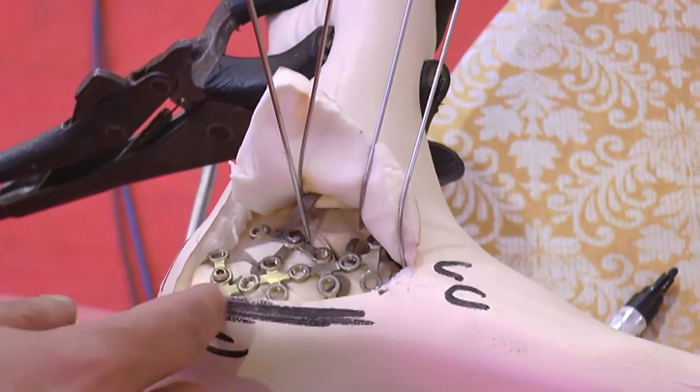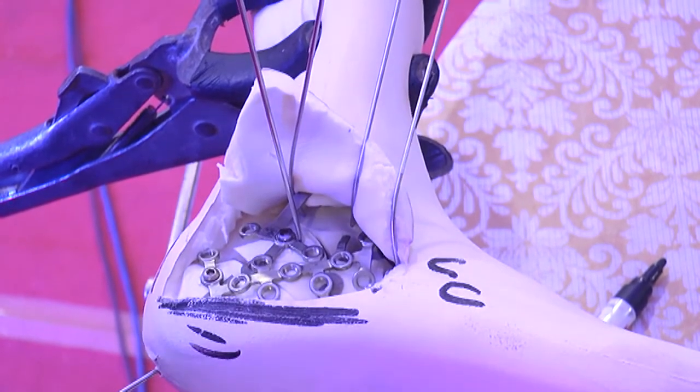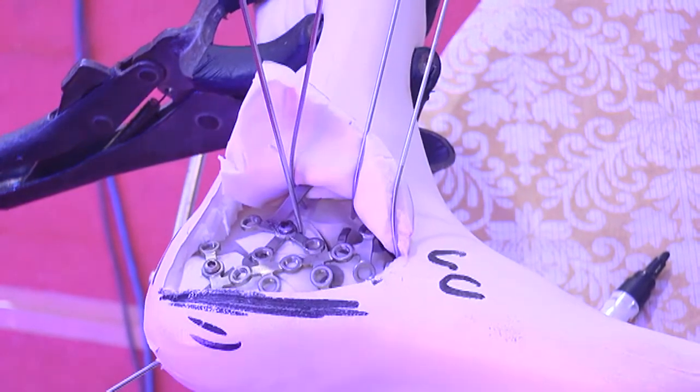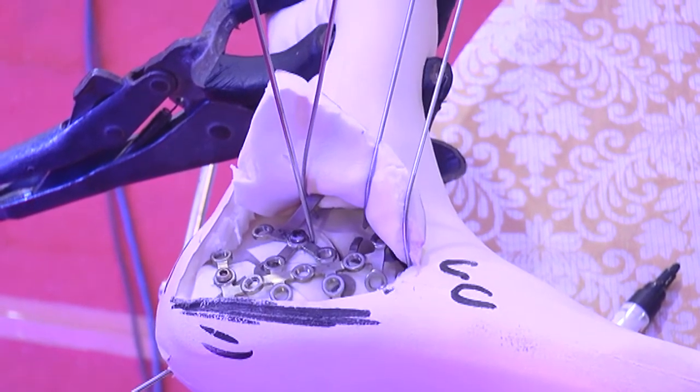And then in the end, obviously, give a good wash and do a very good closure. I generally prefer to put a drain in all calcaneal fractures. Some people may disagree, but I've seen a lot of difference when you do not put a drain versus when you put a drain. A negative pressure, a Romovac.